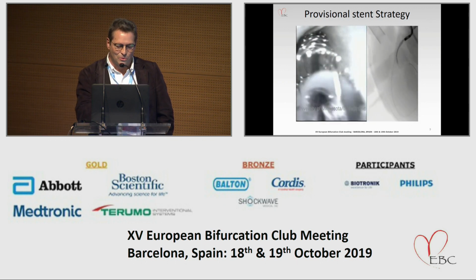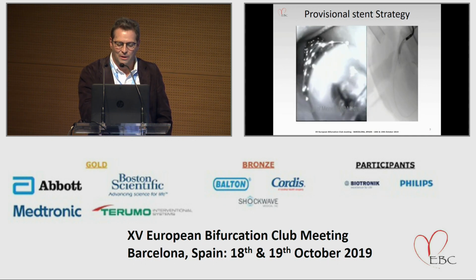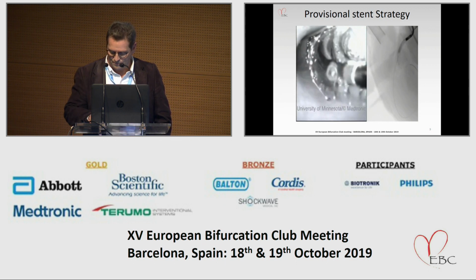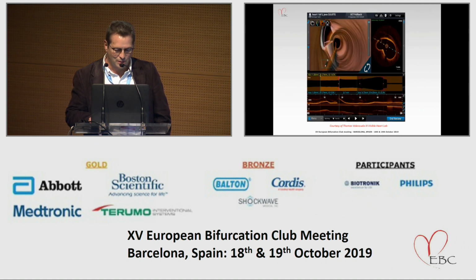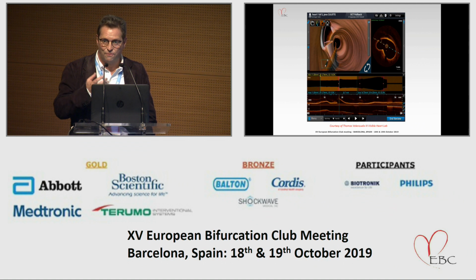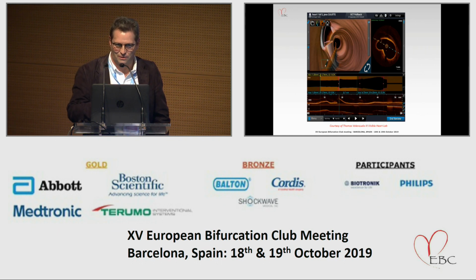And as Francesco told, we were just putting in the stent with respect to the distal diameter and keeping the proximal part floating. And then, if we look into it, there we have the bifurcation, and there we have the takeoff. I guess it's basically the same that we saw from Francesco. So we have now a stent put in the vessel, crossing the side branch, floating in the proximal part, but partly well opposed in the distal part. And that's where we are. But we have to continue to treat this lesion.